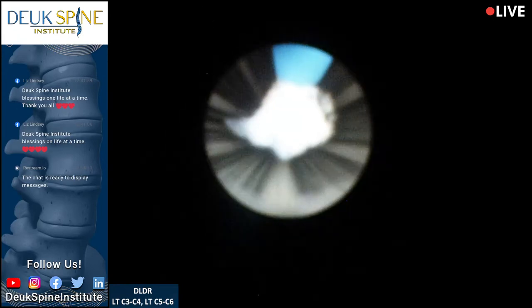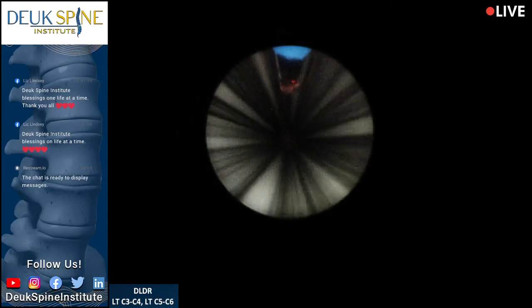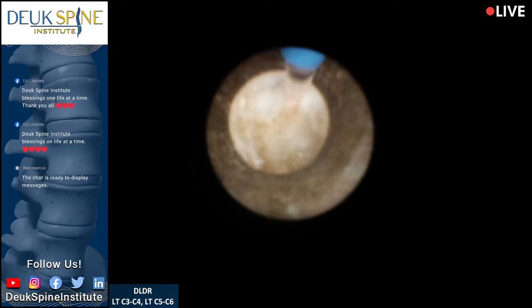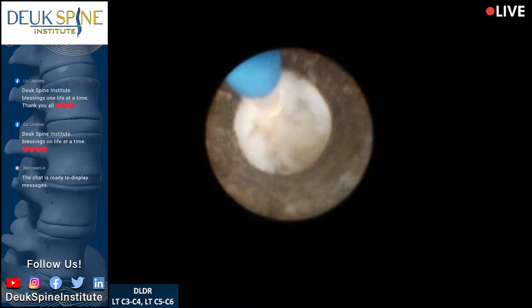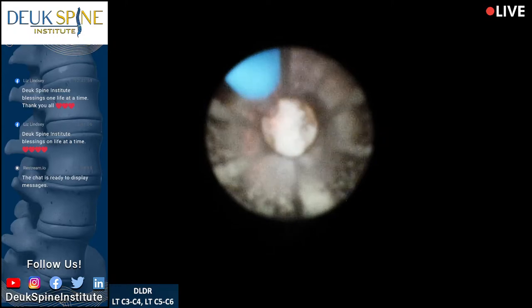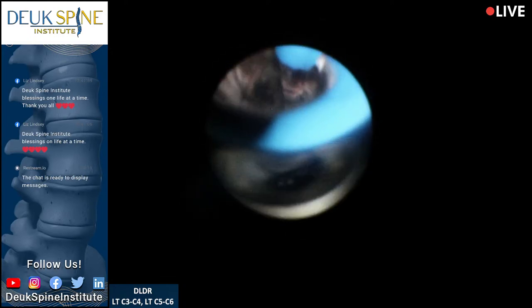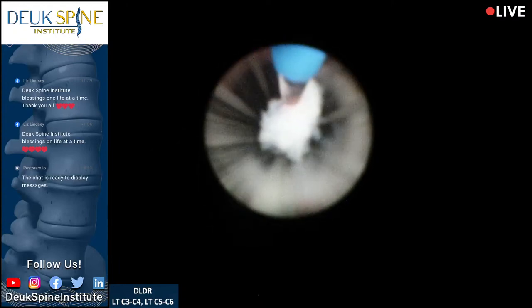See that little piece that came out? I need five more minutes on this disc. Now, normally the discs we fix are adjacent to each other, but this is an unusual circumstance where the herniations we're fixing are apart from each other. This stuff isn't stained blue because the scar tissue blocked the stain from getting to it.